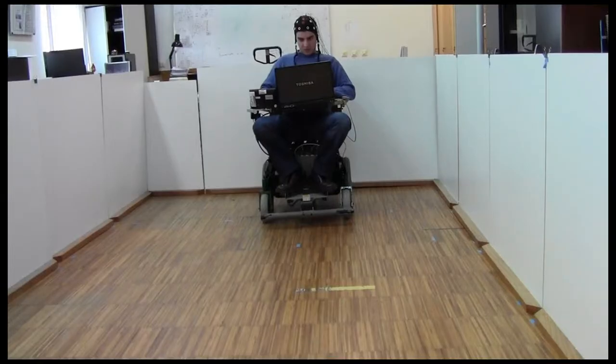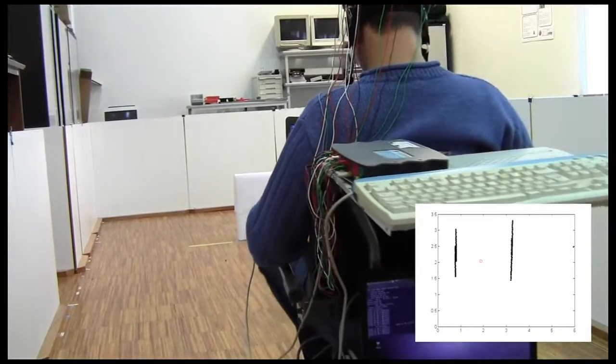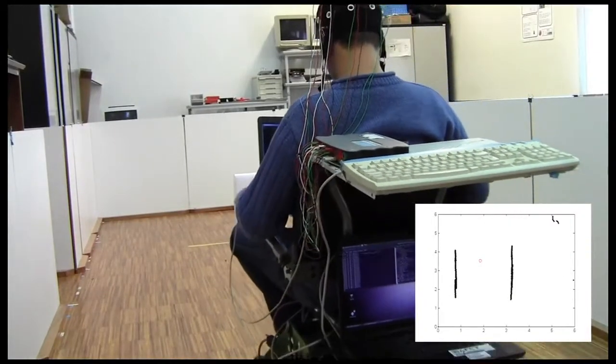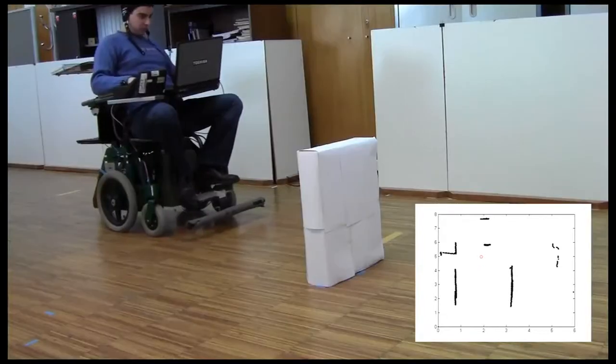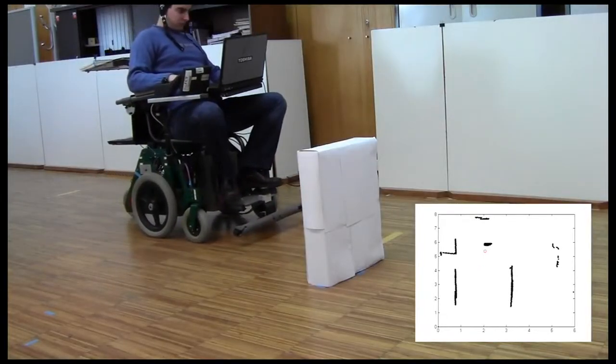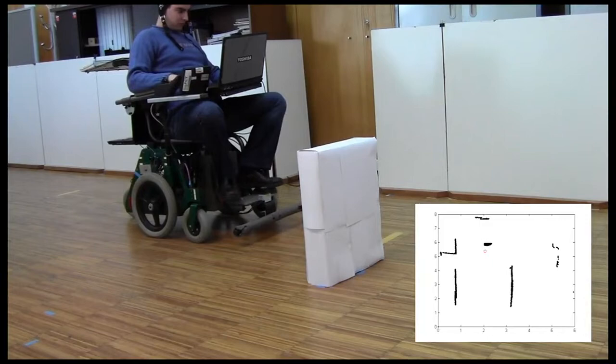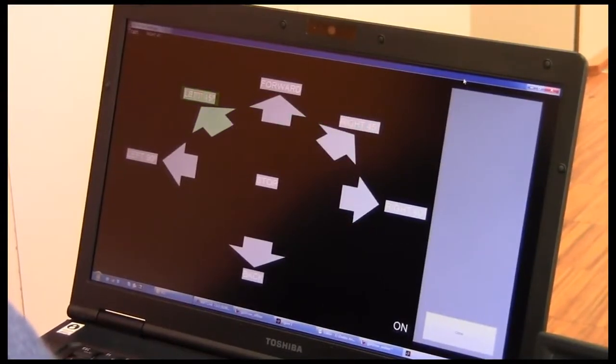The first test scenario consisted in steering the wheelchair in a structured known environment. When the wheelchair reaches certain target points, where a steering decision is required, it stops and waits for the BCI command. This user needs 3 repetitions to carry out command selection.